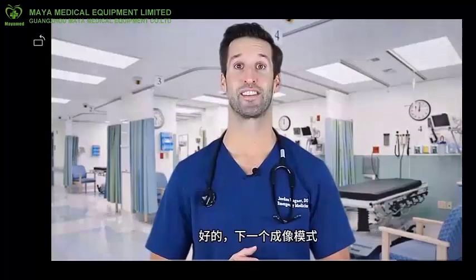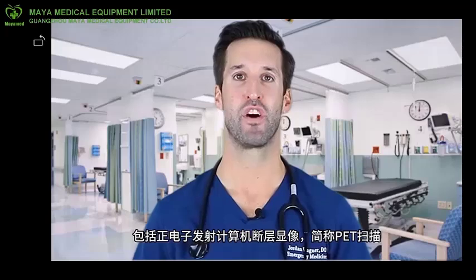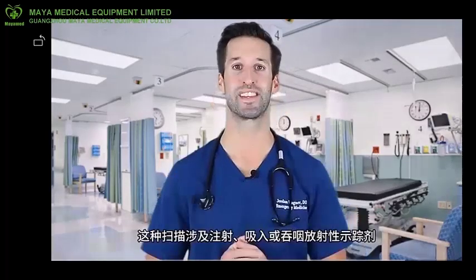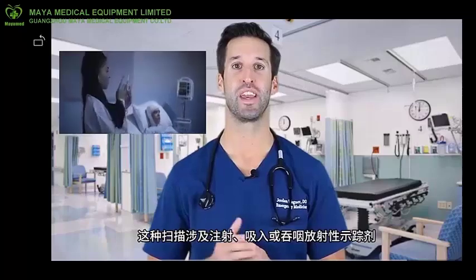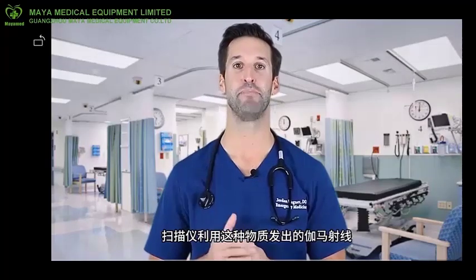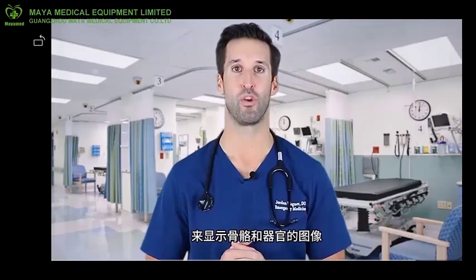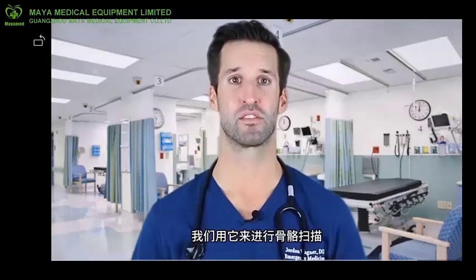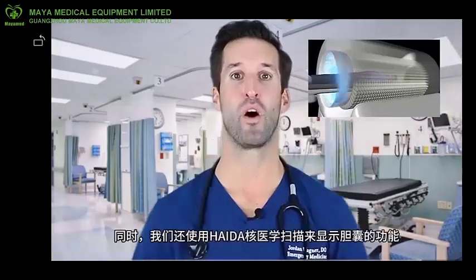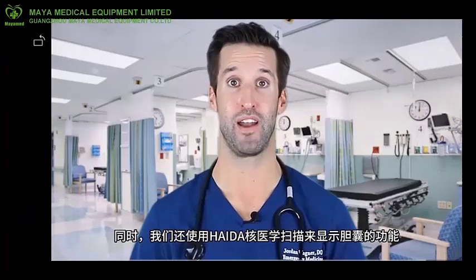All right. Next imaging modality: nuclear medicine imaging, including positron emission tomography, otherwise known as the PET scan for short. This scan involves the injection or the inhalation or swallowing of a radioactive tracer. The gamma rays emitted by this material are used by the scanner to show images of bones and organs. We do this for bone scans, PET scans, which are used for monitoring cancer and other active processes, while we also use the HIDA nuclear scan, which shows the function of your gallbladder.